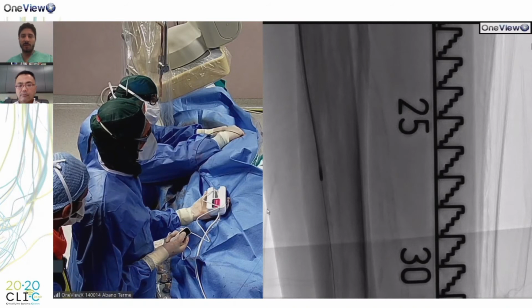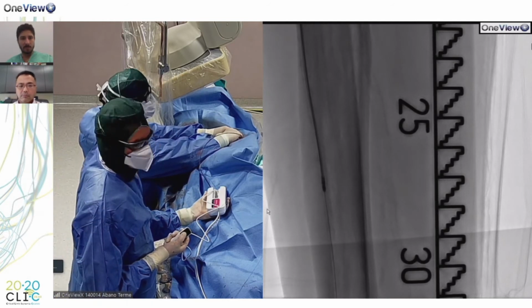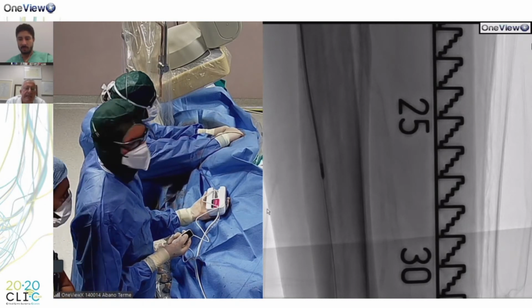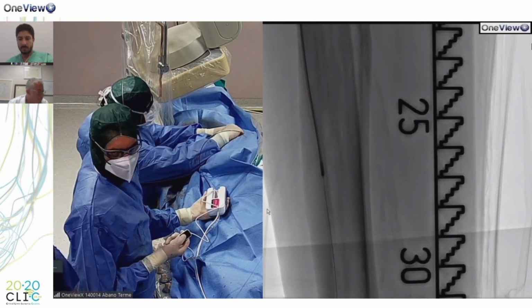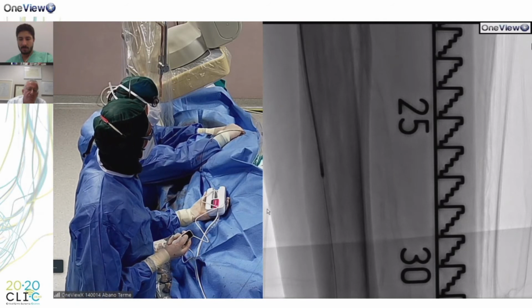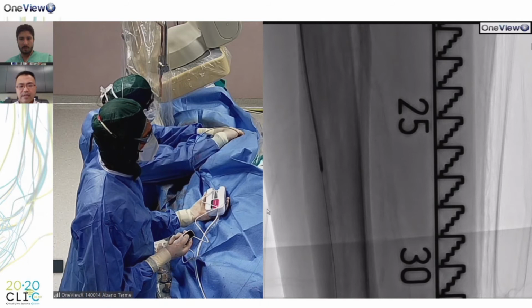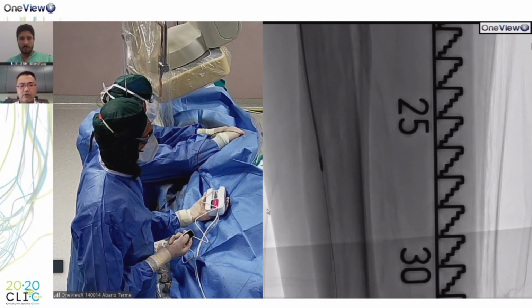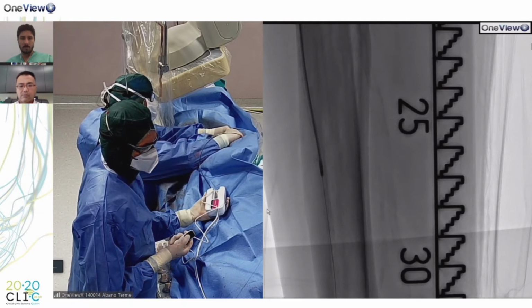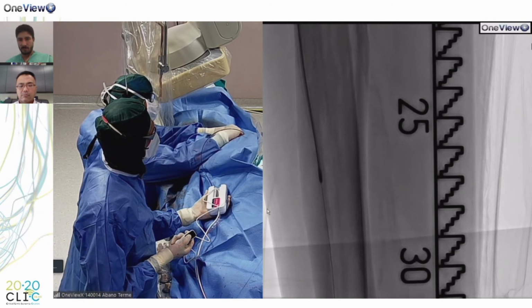Do you have any comment from the cath lab, Marco? How is it going? Can you hear the noise? There is a reduction of the engine power. So Marco, how fast do you advance the catheter? Is it based on look, feel, and listen? You hear the sound and have to look at the catheter? Yes, I'm trying to push the catheter very, very slowly. But when the tip is arriving against the occlusion, you can see and hear the variation in the rounds.